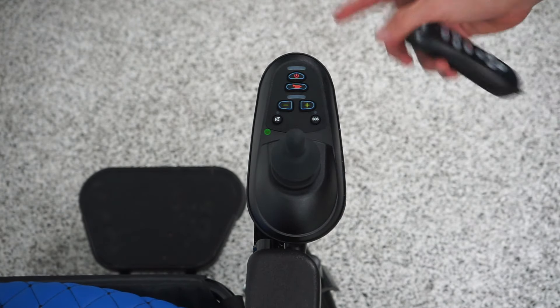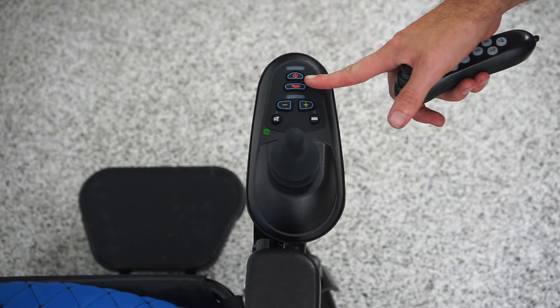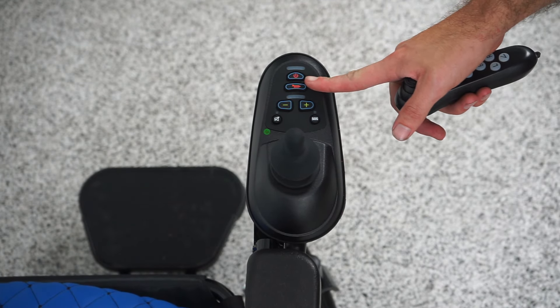I'm Scott with Mark's Mobility. Today I'm going to show you how to pair your remote with the ComfyGo IQ7000 or IQ8000 joystick by ComfyGo.